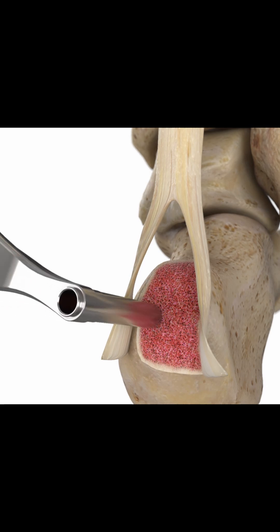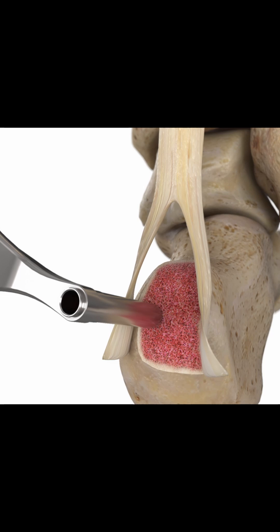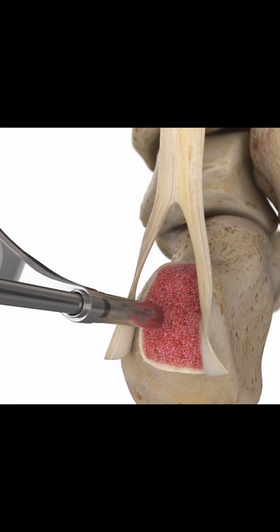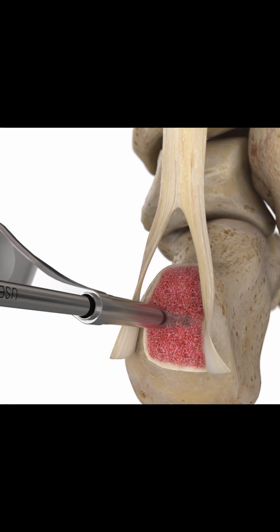The site is prepared for the two 4.75 mm Alphavent anchors featuring 1.8 mm X-braid tape with needles by drilling with the 3.4 mm Alphavent drill through the 3.8 mm Alphavent drill guide.